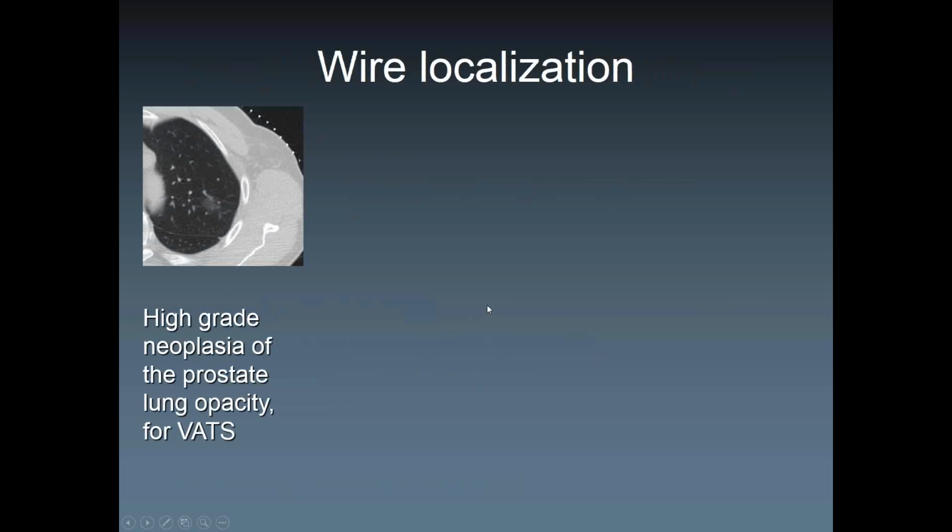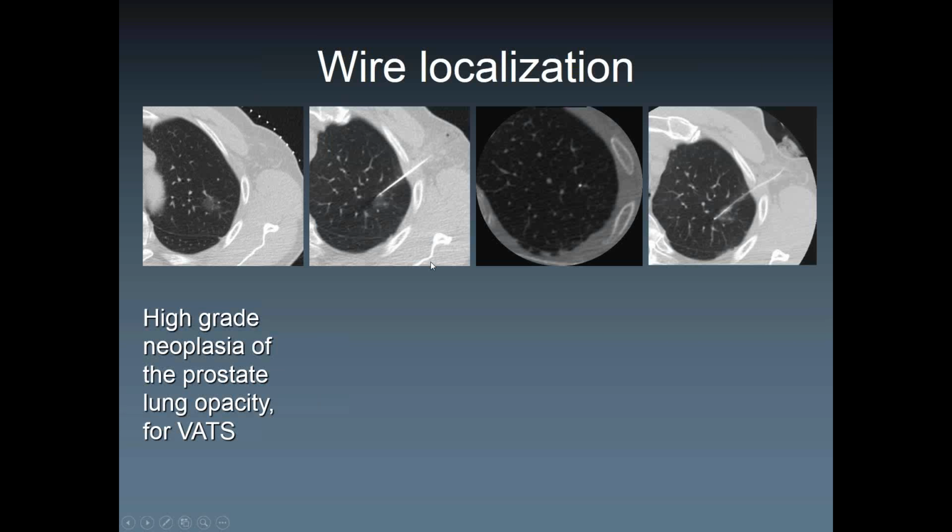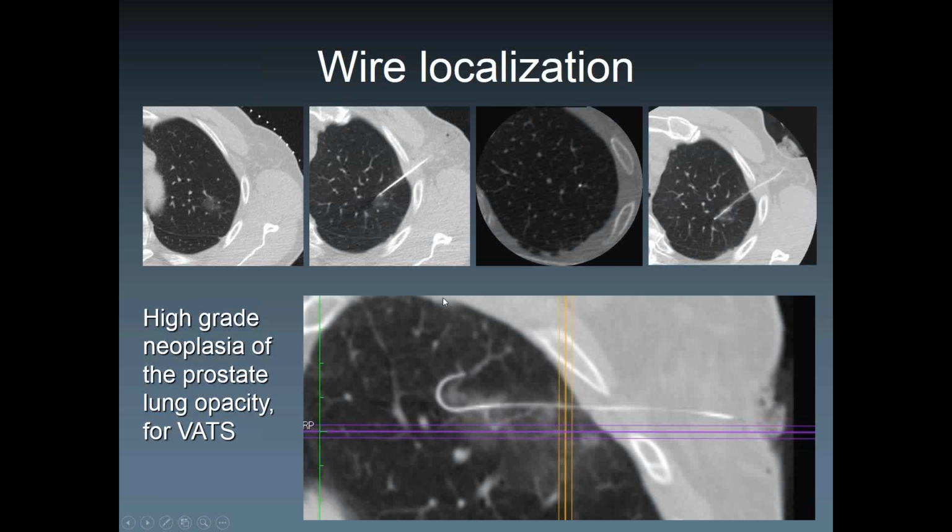Another thing you want to keep in mind and you want to offer if you cannot do a biopsy is you can wire mark things. It means that you place a needle in there with a wire. This is a wire from the mammography colleagues, from the breast section. It's a hook wire, and you leave it in there, and then the surgeon takes the whole section out if that's what they want. But it has to be orchestrated with surgery, obviously. The patient goes straight to the OR with the wire in there. Nowadays we place gold anchors, so little markers in here rather than a full wire. But some surgeons still want the wire and not the anchor.